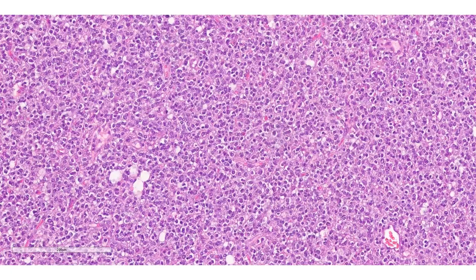Look at the histology, beautiful histology for oligo: very monotonous, round, regular nuclei surrounded by perinuclear halo, which is just cytoplasmic vacuolization in FFPE sections. As we said many times in this conference, all of the oncologic surgical pathologists know that in a frozen section, you will not see the halos. And furthermore, the freezing process distorts the nuclei.